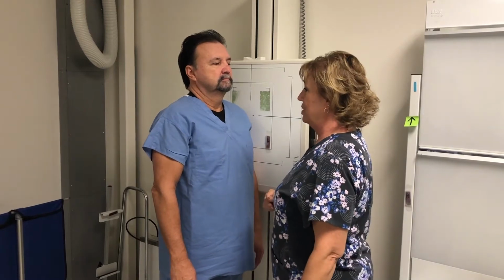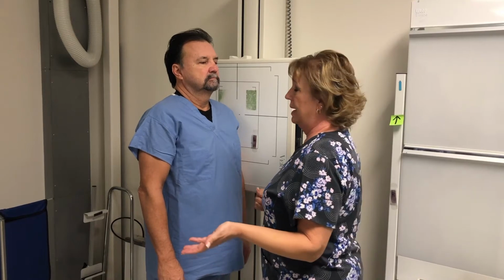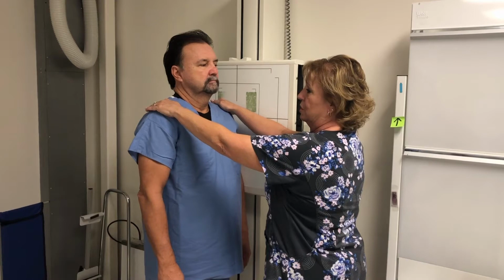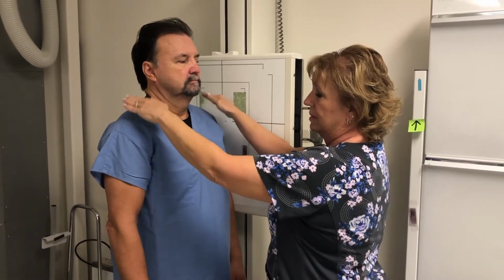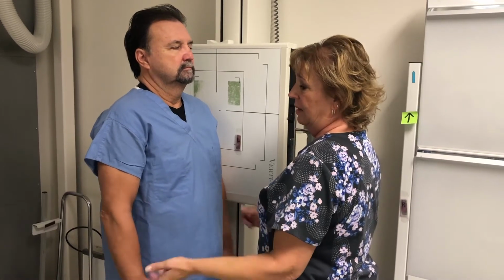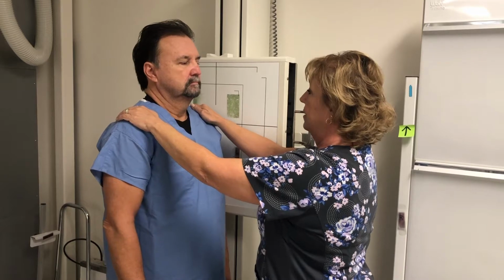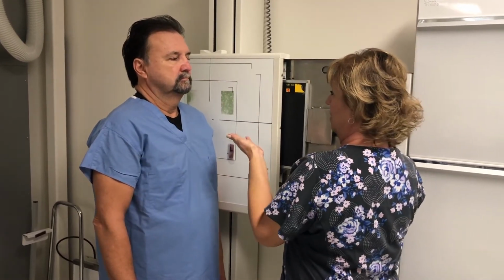Okay, we have him set up now for a lateral projection. When we get to trauma later in the spring, I'll show you how to do a cross table lateral. But for the upright, which is recommended because the shoulders are going to be in the way, doing him vertical or standing up allows him to depress the shoulders a little bit. You could have the patient hold weights. I'm not going to demonstrate that here because I'm also going to show you how to do a swimmer's view standing. So what I want to do, I have it opened up to a 10 by 12.